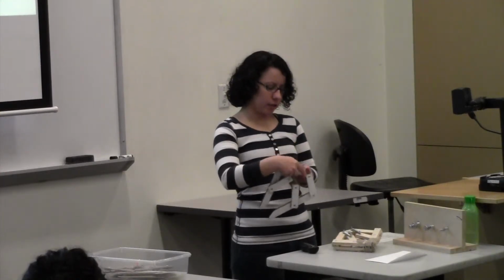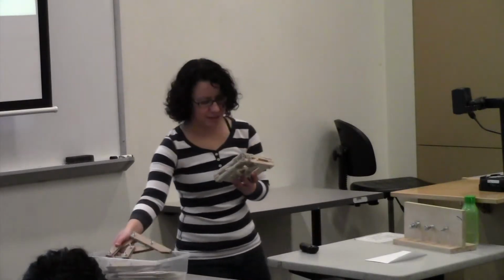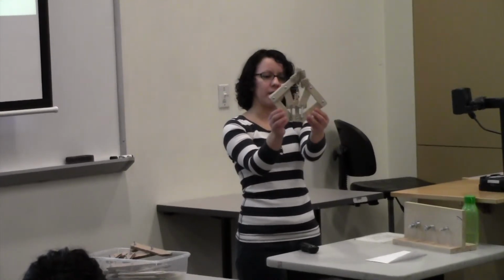So this, I tried to glue it here, it didn't work, so I ended up going with plan B, and it worked out even better. And on this one, I just cut it out as one piece, so then I didn't have to worry about reinforcing it and not having it move.